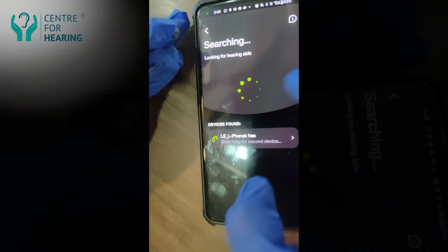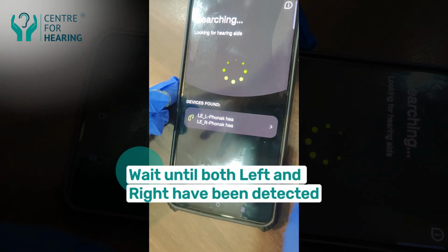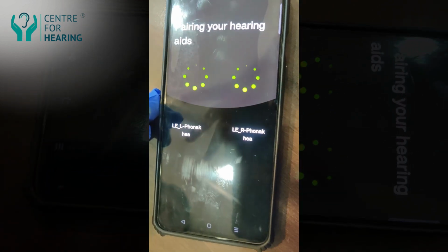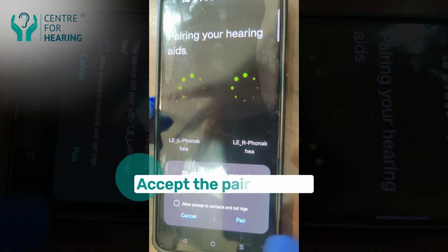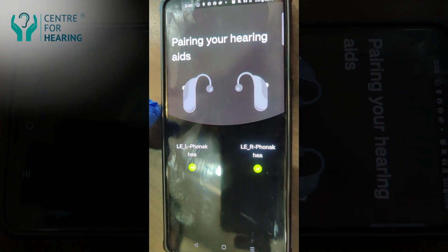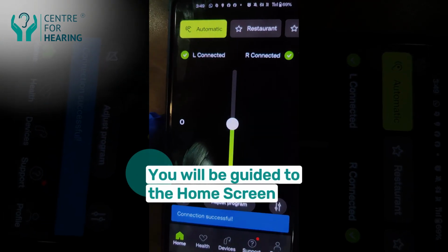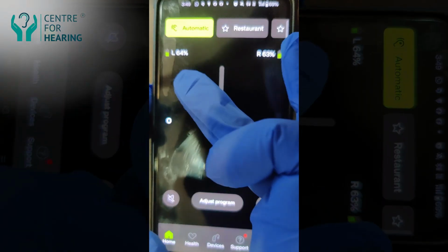Now it is searching for the device. The left one got detected. You have to wait until both get detected. Then click on the arrow. Accept the pair request. It will guide you to the home screen. So now it is connected and it is showing the battery.